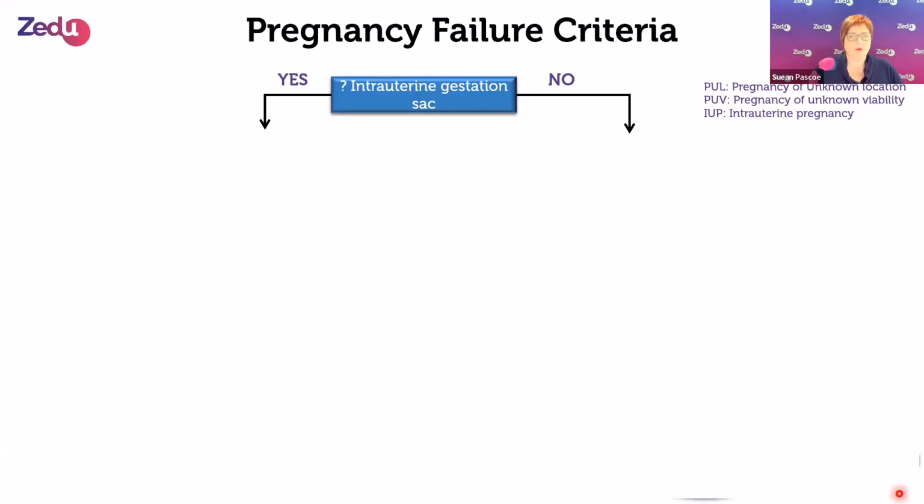And so we've put together this simplified version or decision flow chart, if you like, to help with this. As I mentioned, your local protocols are likely to be much more detailed than this, with recommendations exactly for when you should and shouldn't follow up. But we've simplified it here from the point of view of those key structures that we're looking at. How do we know whether we need to rescan or not?